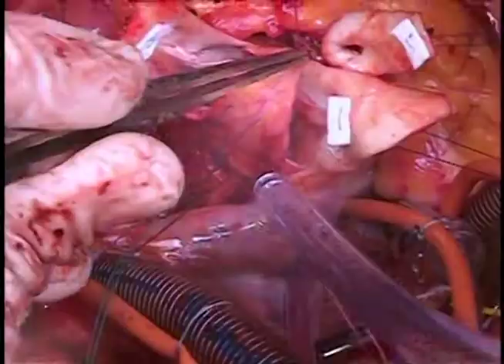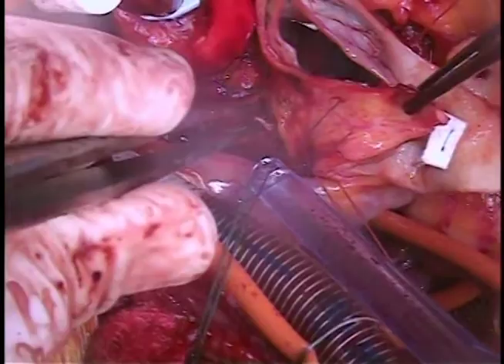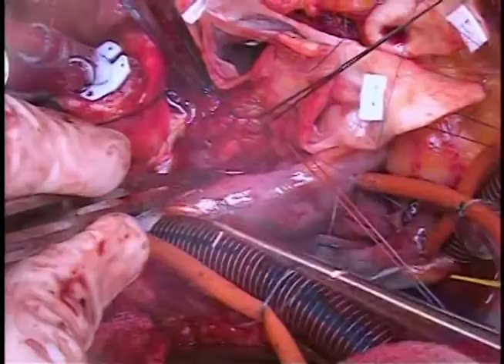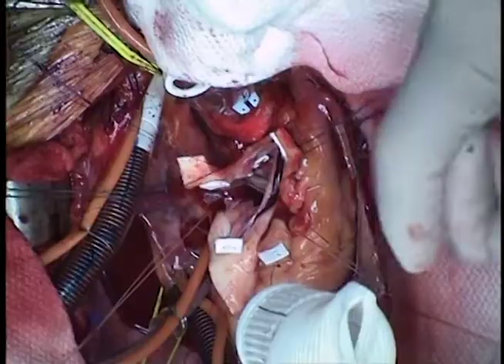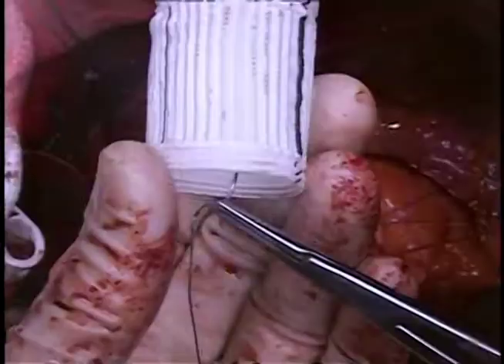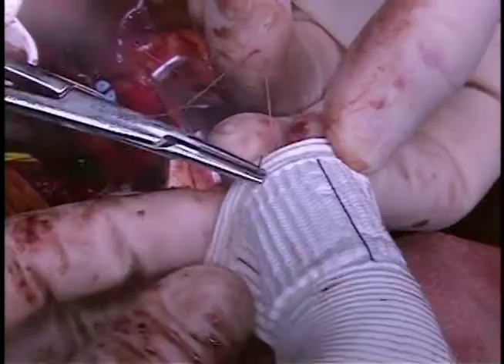Be cautious to avoid heart block, but you need to take these well under the annulus. Notice that the commissures have already been marked with 4-0 prolene pledgeted suture just above the origin of the leaflet. This helps splay out the root and provide perspective. Take the 2-0 sutures through their respective spots on the graft. Sometimes it helps to mark the graft at six spots to ensure symmetry. Symmetry, subannular sutures, and staying in the same plane are key to a successful valve-sparing procedure.